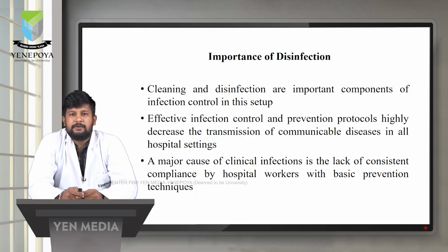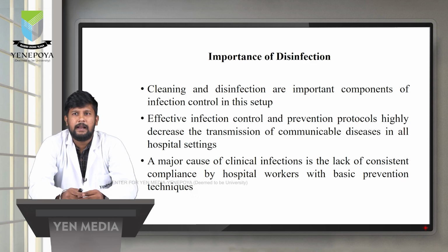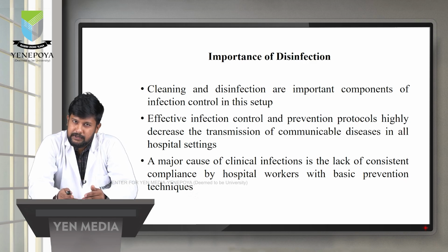So coming to the importance of disinfection, cleaning and disinfection are important components of infection control in the operating room. Effective infection control and prevention protocols highly decrease the transmission of communicable diseases in all hospital settings. Major causes of clinical infection is the lack of consistent compliance by hospital workers with basic prevention techniques.